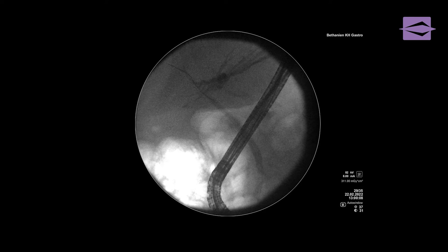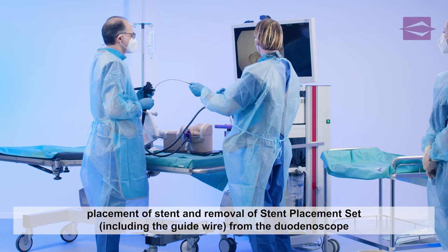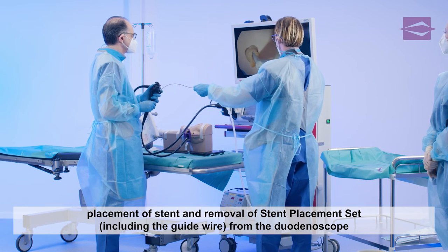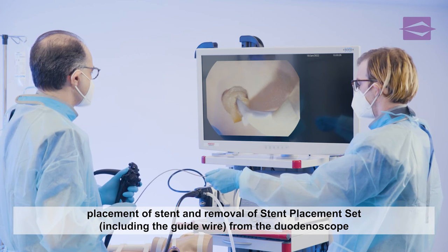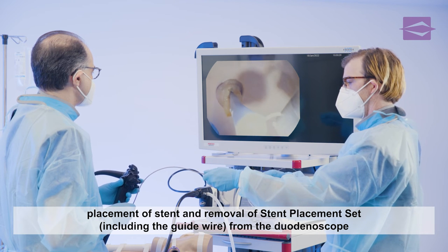The correct position of the stent is now clearly visible on the x-ray monitor. Once the stent placement set and guide wire have been pulled first through the stent and then out of the working channel, the final position is assessed again on the monitor. The stent is now placed.